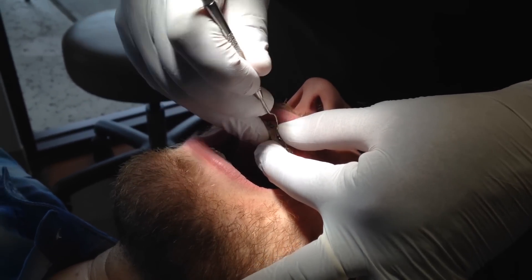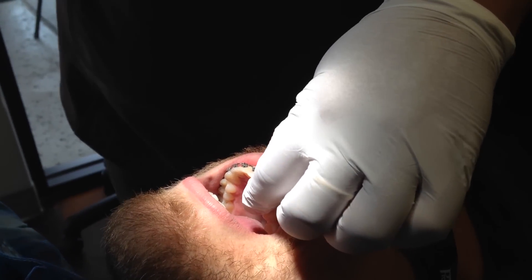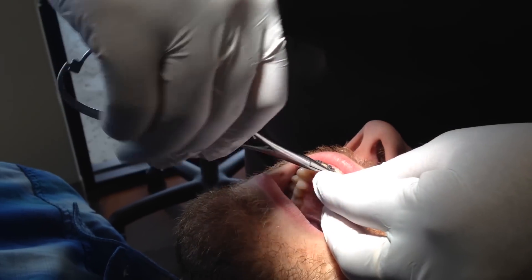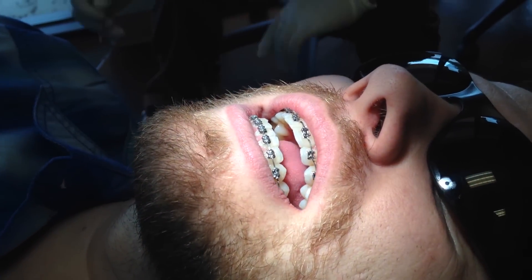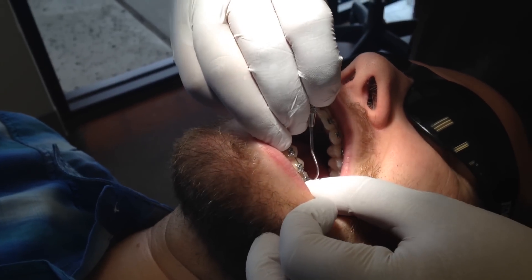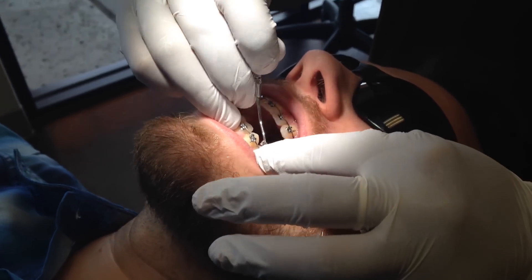So can you pull out one of them Kobe's? You know what we got is... I don't want one of them long Kobe's. Yeah, I'll use that. Okay. Are you twisting the wire? He might need to, I don't know. Let me know. I don't know because he's doing details here, so I'm not quite sure. Are you going to want to wire tie any of your details on him? Yes, at least the upper right one.